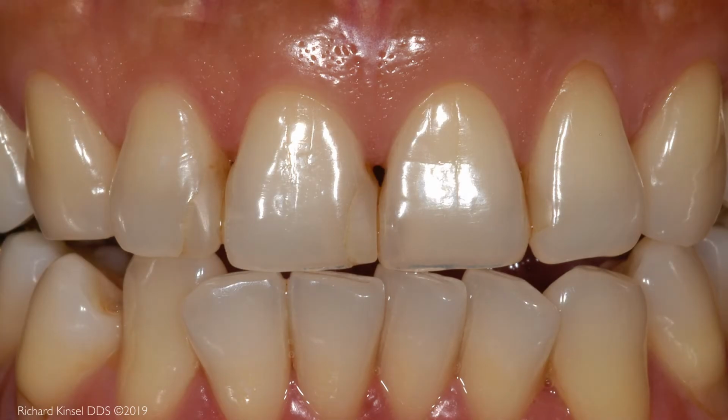This is the intraoral view of the anterior teeth prior to treatment. The large existing composite fillings are seen. Also notice the black area between the central incisors where the gum tissue has receded.